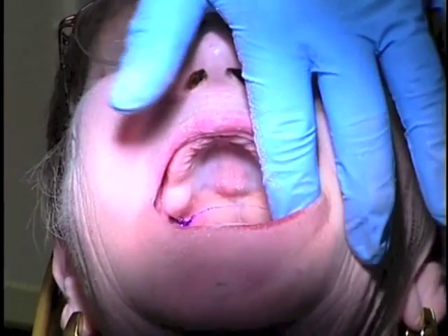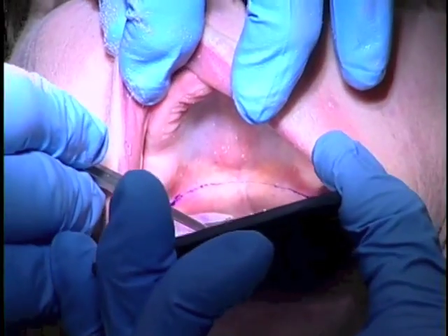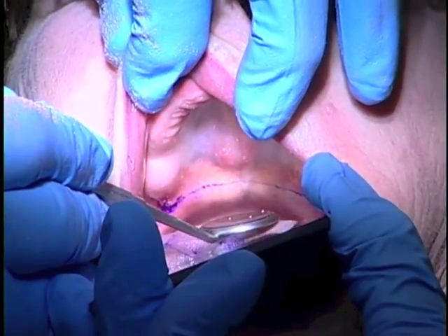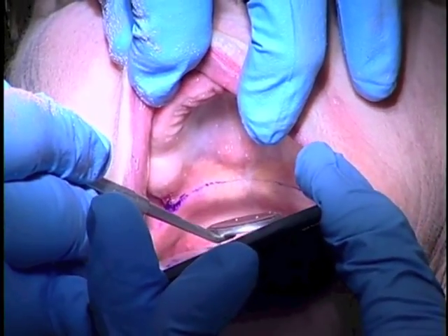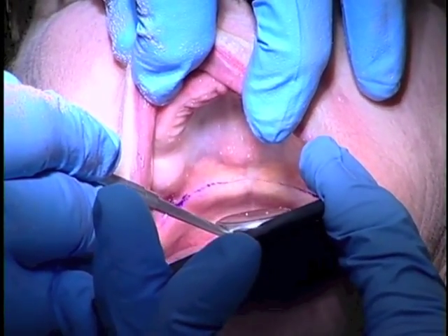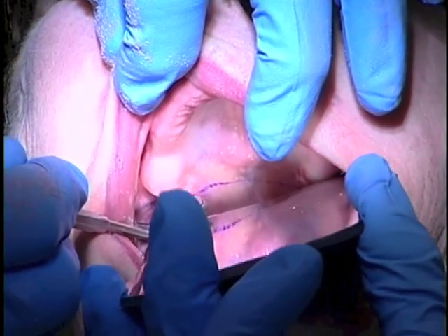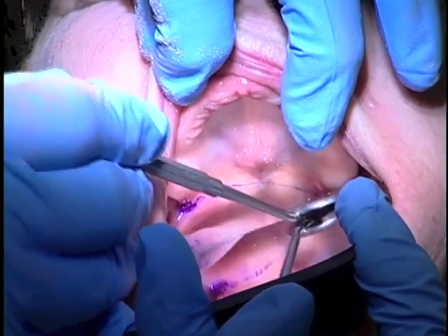Open now — don't allow the tongue to come up and hit it. We will look again at that line and have the patient say ah with short hacky sounds. Now we palpate for the hamular notches on either side, and we see that those marks go right through the hamular notch.